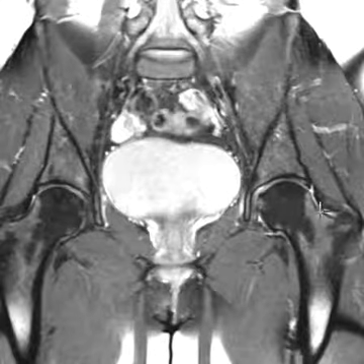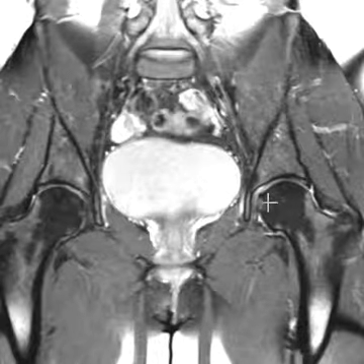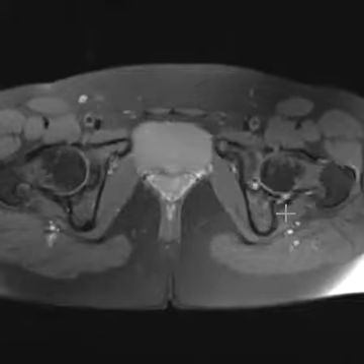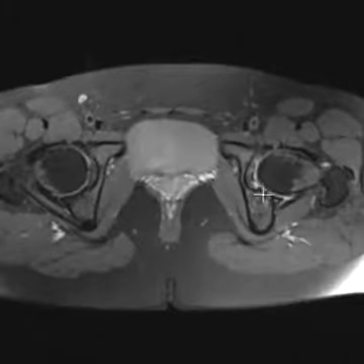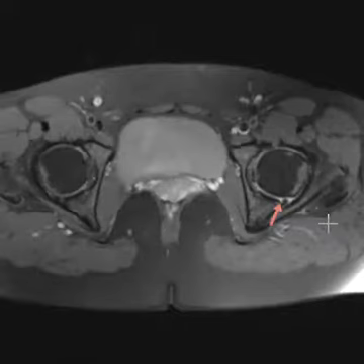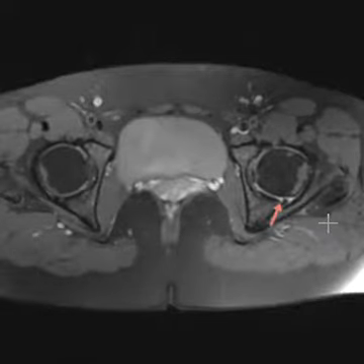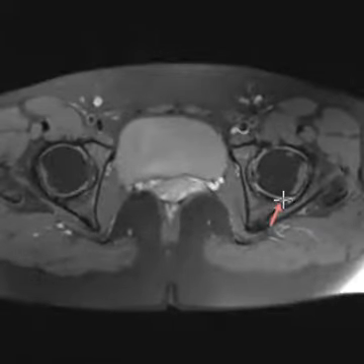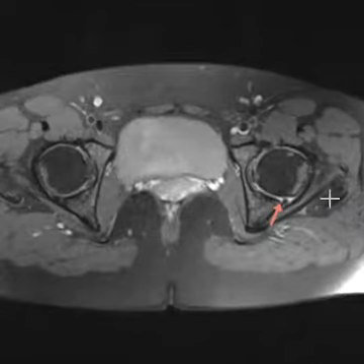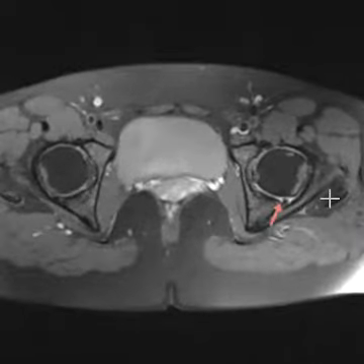Now we're going to look for the posterior hip labrum not in the coronal view but on the sagittal and axial view. If we put up an axial view, we're going to look back here — this is the posterior acetabulum — and there it is. Notice there's a little area of fluid that goes into the tear right there. You can see the labrum and a little fluid going into it.